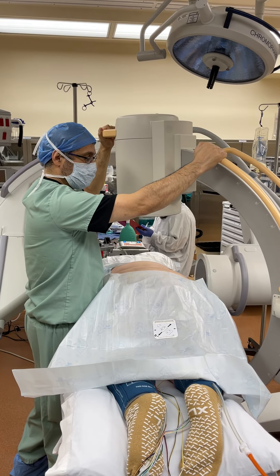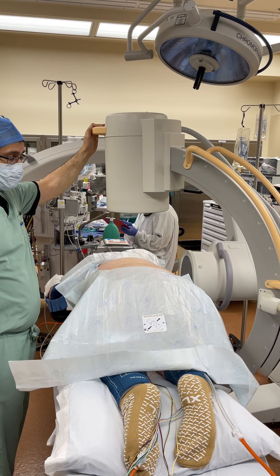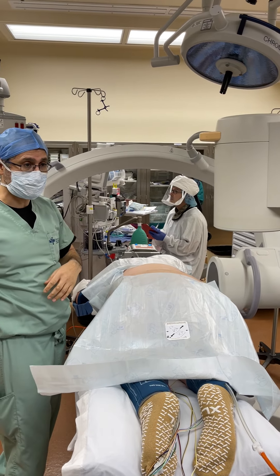I have much more control. Lock it please. Now back up your machine. This is the position. You can stop. Go out. Thank you.